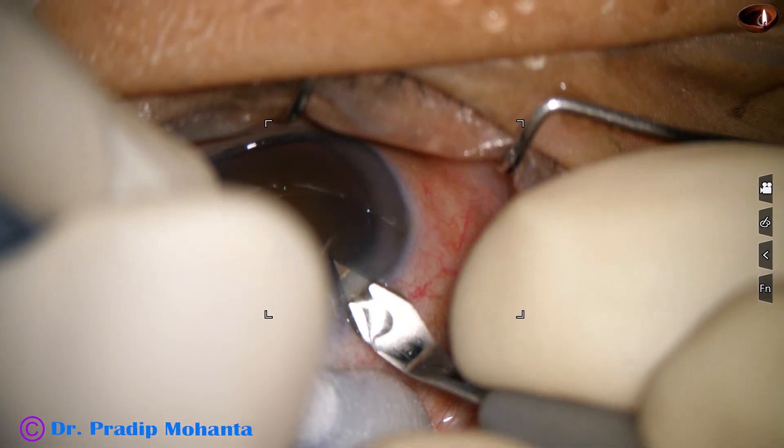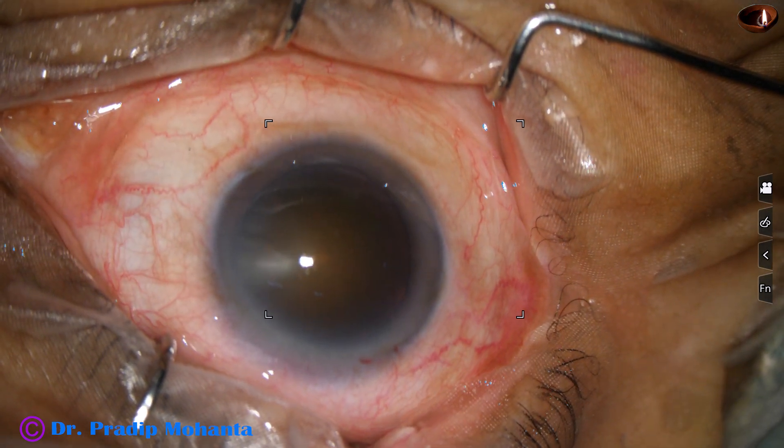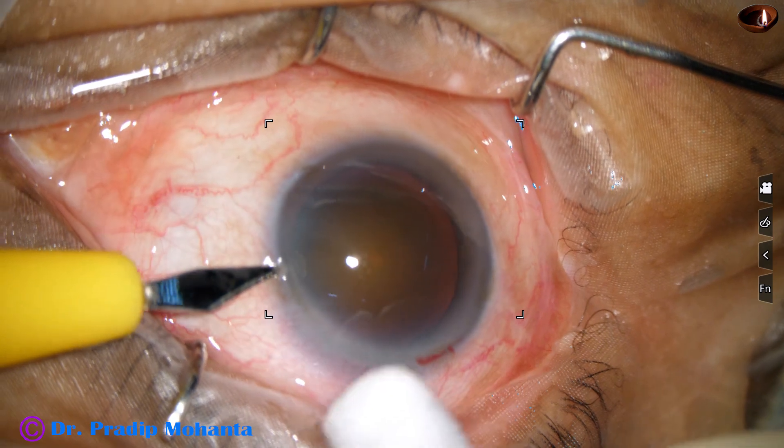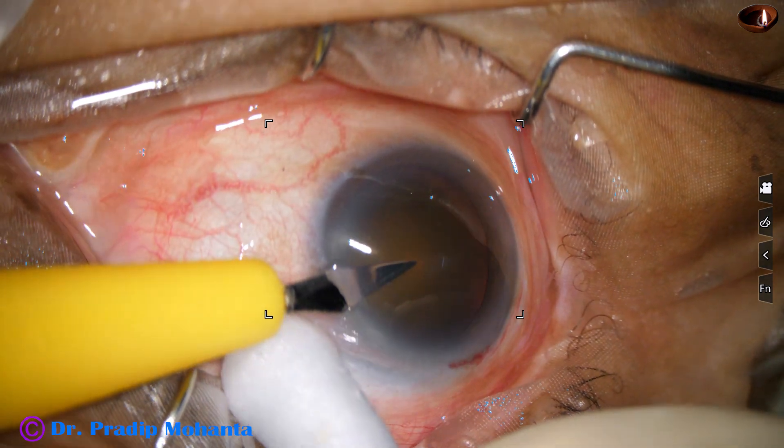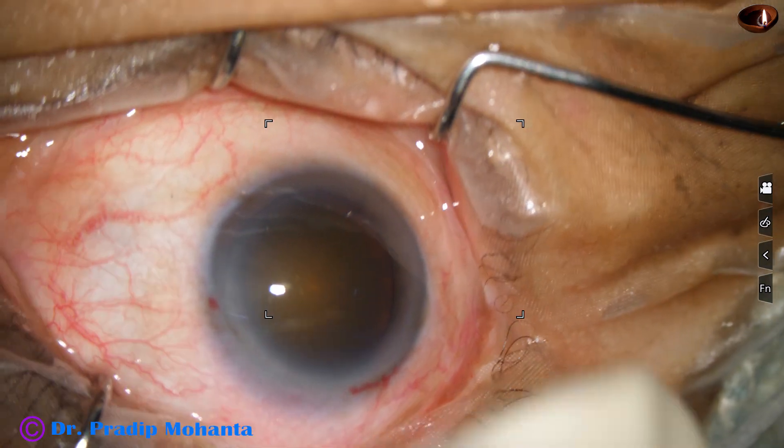This is the main incision with a 2.8 mm steel keratome. And this is a side port on the left side of the main incision, about 3 o'clock hours away.